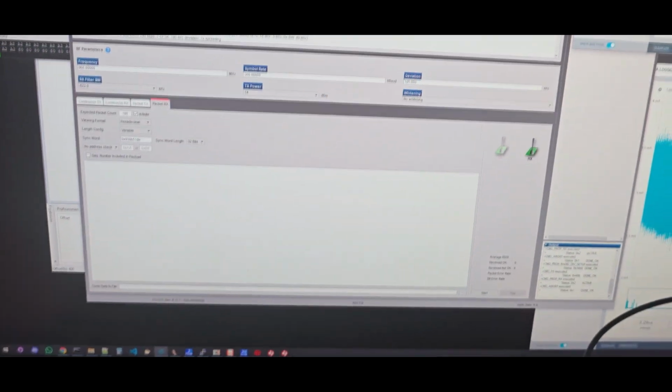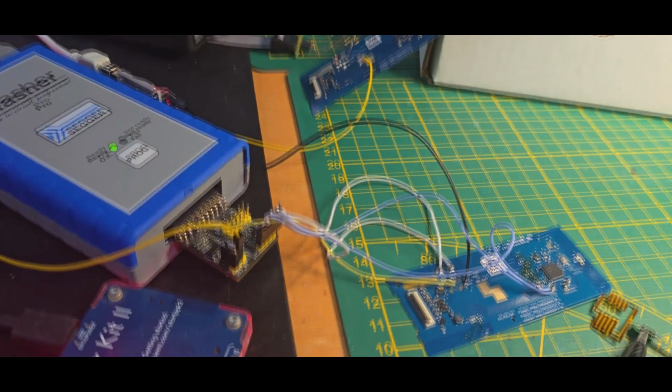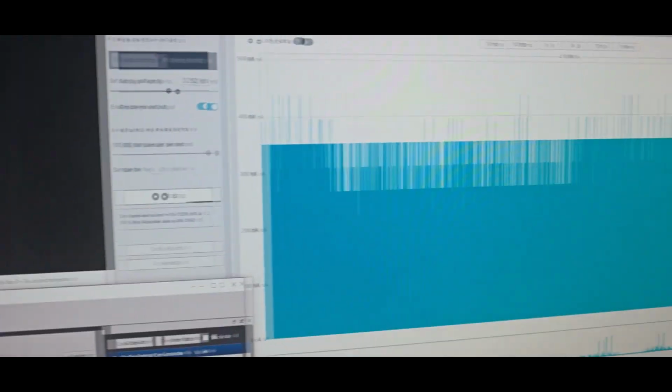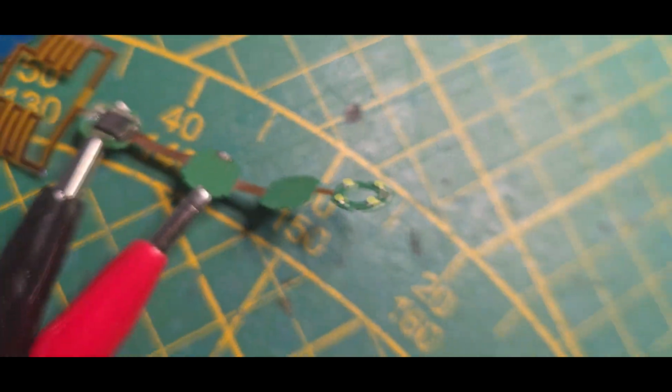I did now take a look inside of the firmware and reverse engineered it quite a lot, and was able to basically find out the right data to create a sniffer for it. And for that, I'm using the Texas Instruments own tools and a CC1310 as a receiver. But right now you can see it's not sending anything because the camera is still in sleep mode. And to wake it up, we really have to use this light sensor.